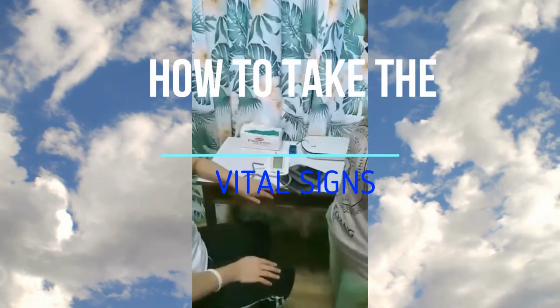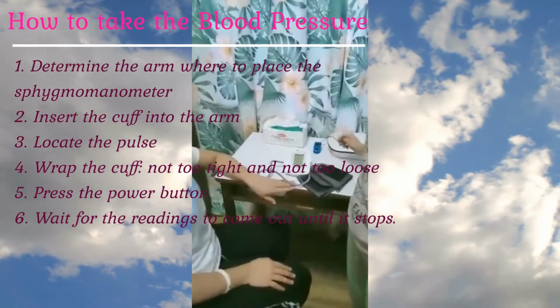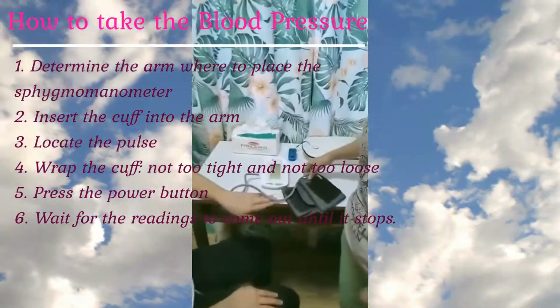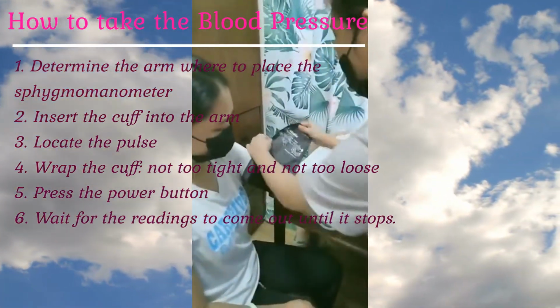And now we are going to show you, or they're going to demonstrate, how to get the blood pressure using a digital sphygmomanometer. First, you have to locate the hand that you are going to use.